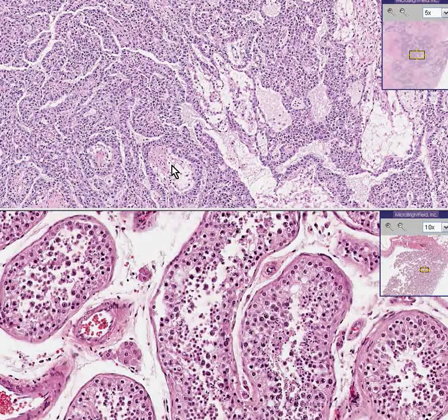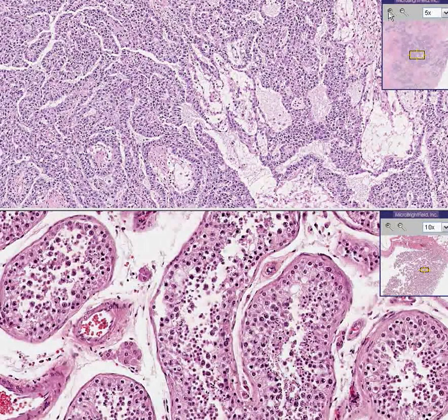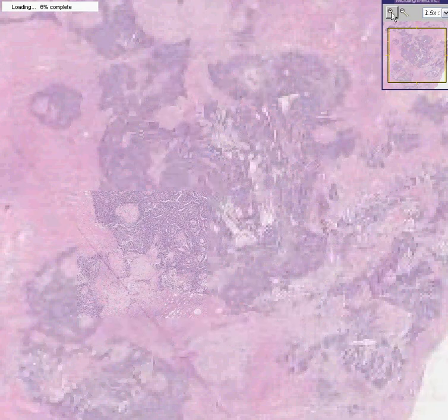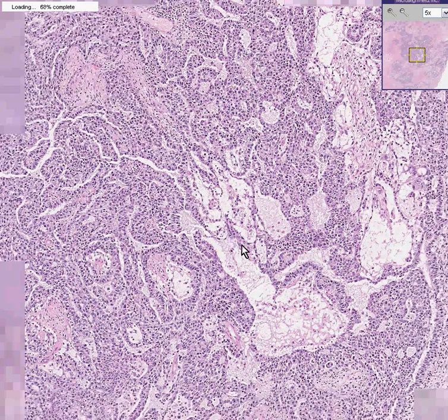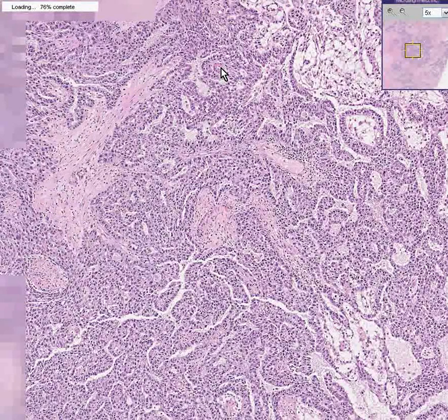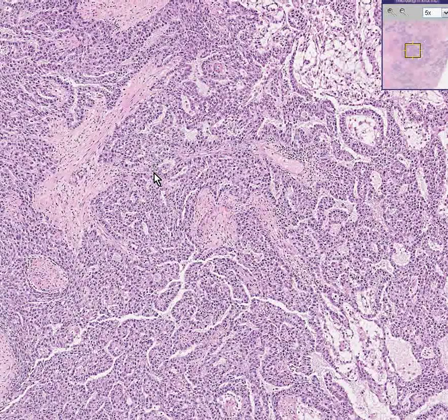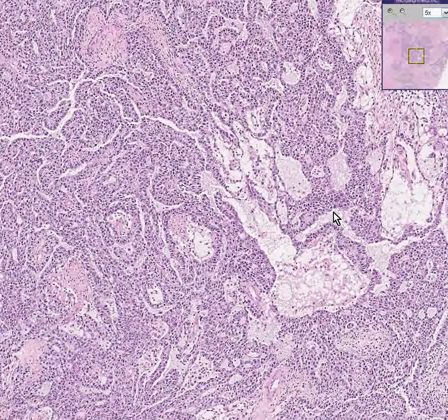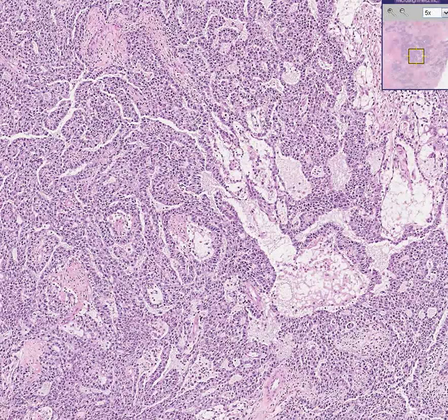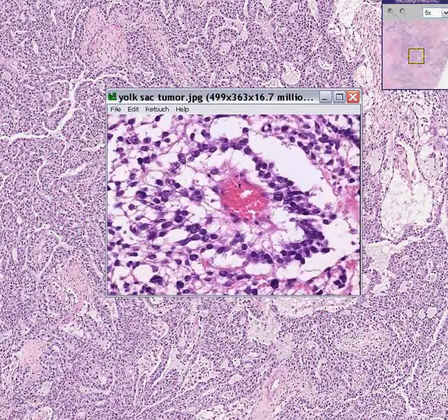Looking at the whole thing by itself, you can see structures where the cells appear to be growing around a vascular area — like a papilla, but with more of a blood vessel in the middle. This is a diagnostic feature of a yolk sac tumor or endodermal sinus tumor. I'm going to bring in a classical example I googled, and you can see how the tumor cells are satelliting the blood vessel in the middle.